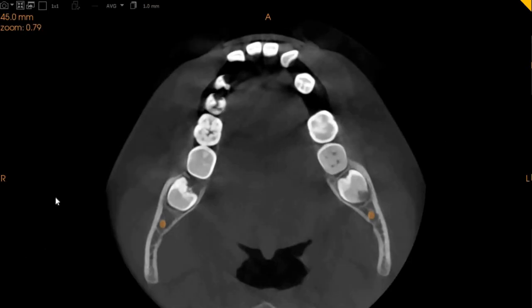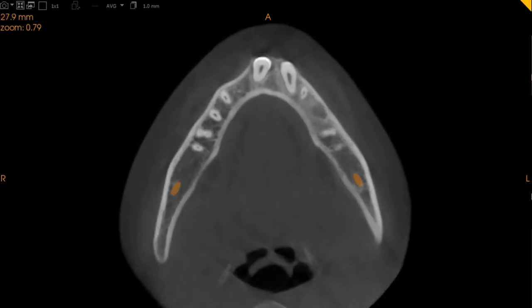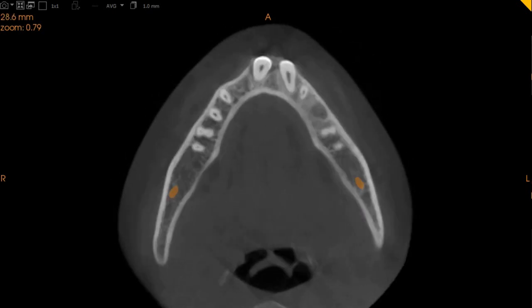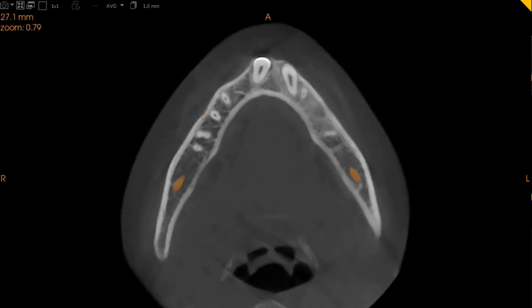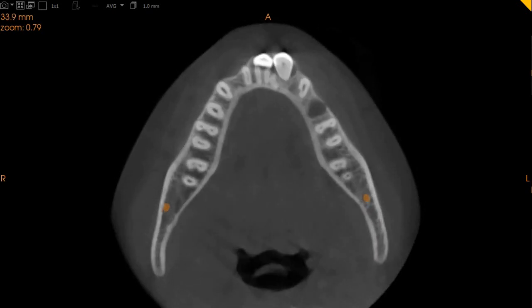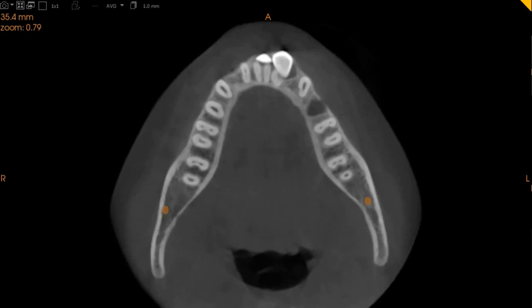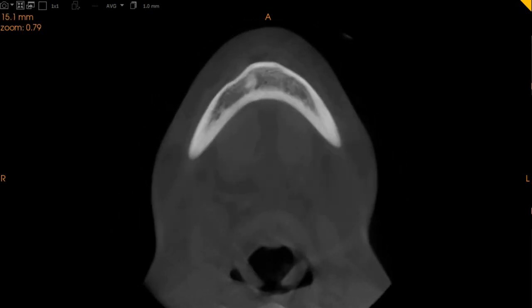This is the axial view, or the top to bottom view. On the axial view, you can very clearly see that we have the lower anterior canines — the lower jaw canines — and both of these canines are impacted. Because of their impaction, you can see that they are present buccally, and the roots of the central incisors are in contact with the canines.